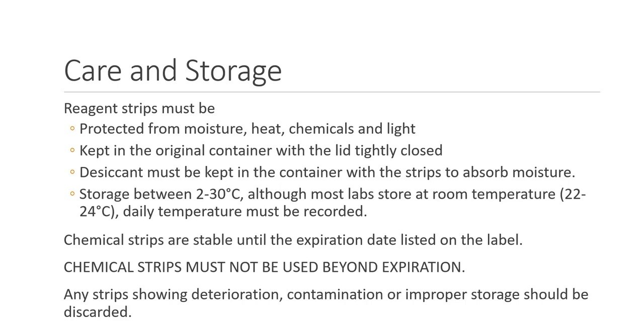Storage between 2 to 30 degrees. 2 degrees is refrigerator temperature, 30 degrees is room temperature. Although most labs like to store them at room temperature, 22 to 24 degrees. The daily temperature must be recorded because, for example, let's say that you're keeping them in the refrigerator and when you record the temperature as 1 degree, that's too cold. And so you have to do something to adjust the temperature to where it's within that acceptable range.